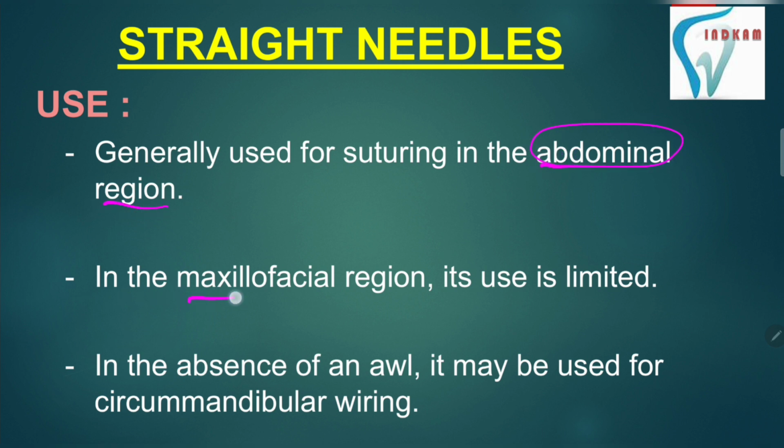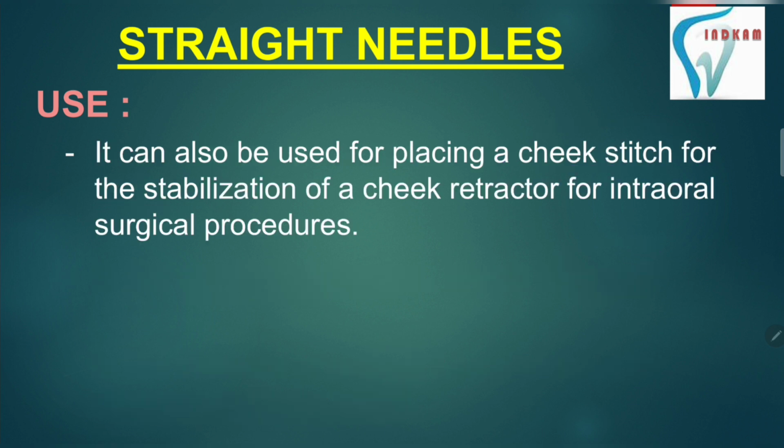Its use in maxillofacial region is limited, and in the absence of an awl, it may be used for circummandibular wiring. It can also be used for placing a cheek stitch for the stabilization of a cheek retractor for intraoral surgical procedures.